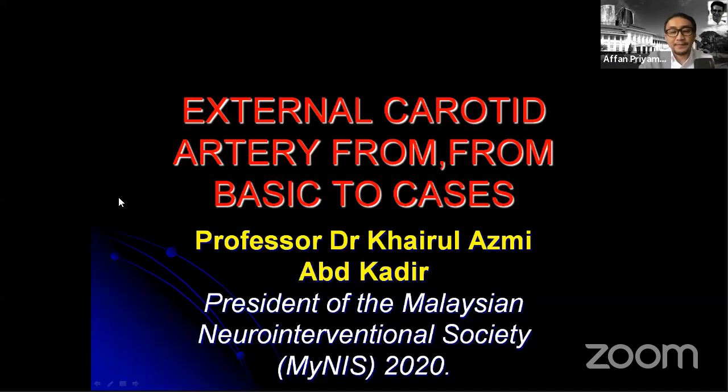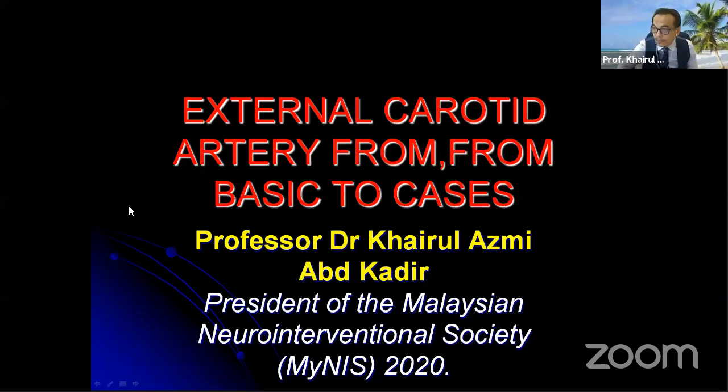Okay, actually, thank you very much for this very excellent lecture from Dr. Kitipong. I prepared more cases rather than basic anatomy, because Dr. Kitipong gave an overview of the anatomy and extracranial anastomosis, and it was very excellent. So I will go on, and we can also see how we interpret the basic anatomy to tackle the disease. And Dr. Kitipong can also help us with how to tackle the disease that we see during the procedure.